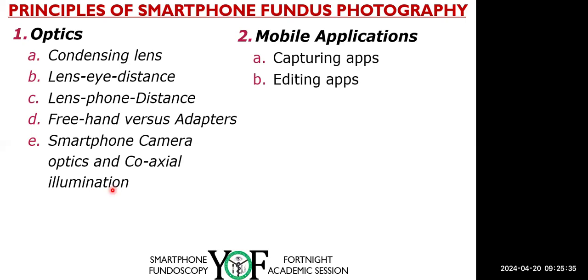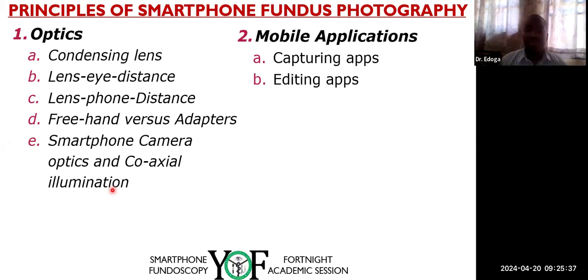All right. So it's important that you understand this fact when you want to choose a mobile phone and then the app. So at the end, in part 2, I'm going to show us how to obtain the app from the App Store. Human Indirect has an Android version, which is no longer being supported, but I can share a Google Drive link that you can click and download it on your Android device. It may help some people who don't have access to that.